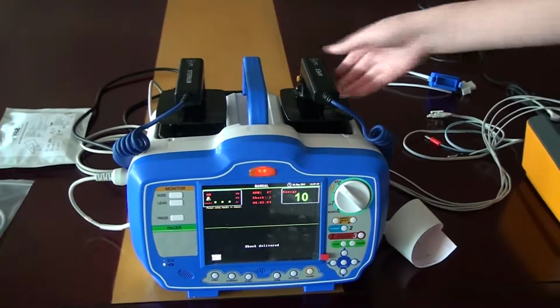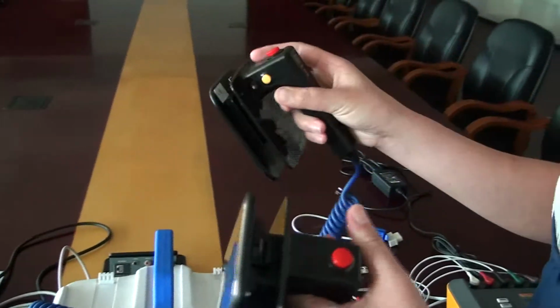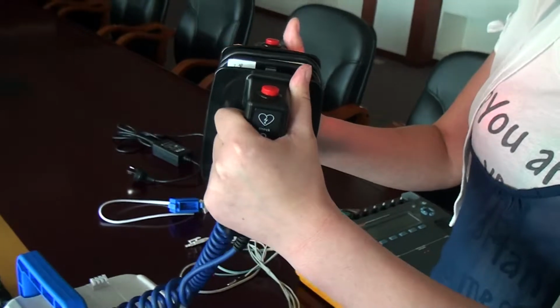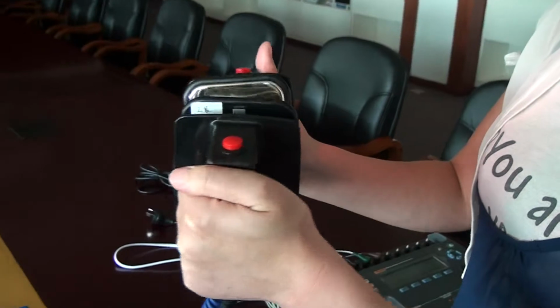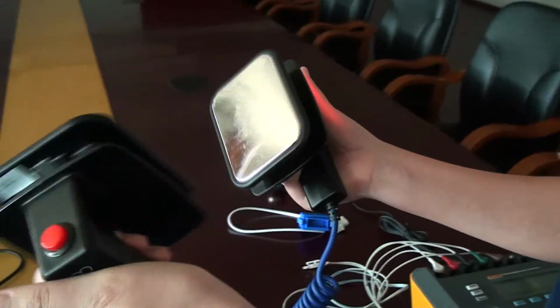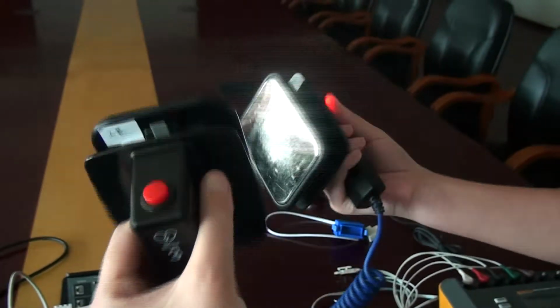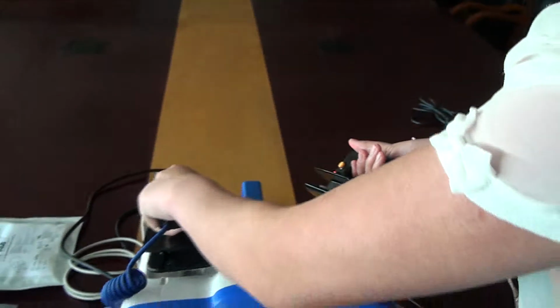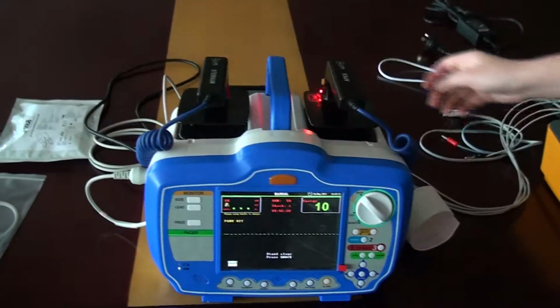And there's one thing we need to remind the customer. After pressing charge, please do not put the handles together to shock, because it is very dangerous and may damage the device because of short circuit. So if you want to demo, then just put it to the device to show.